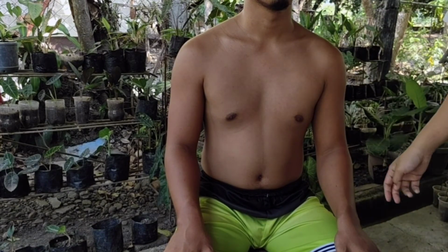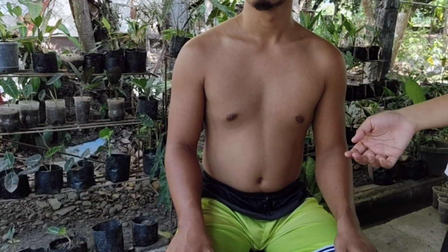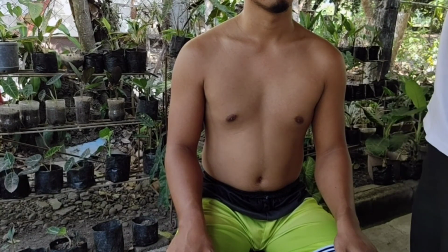And then next is we auscultate using our stethoscope.